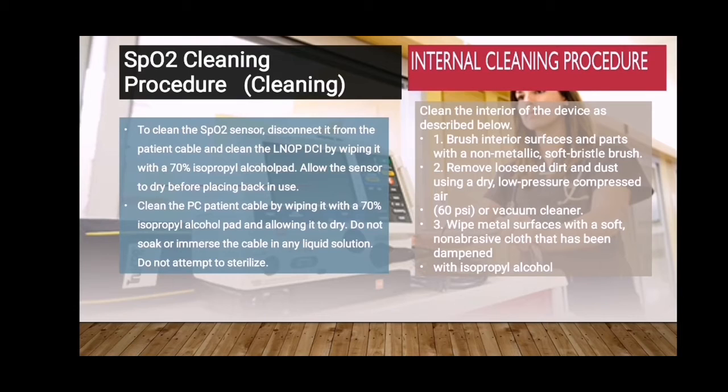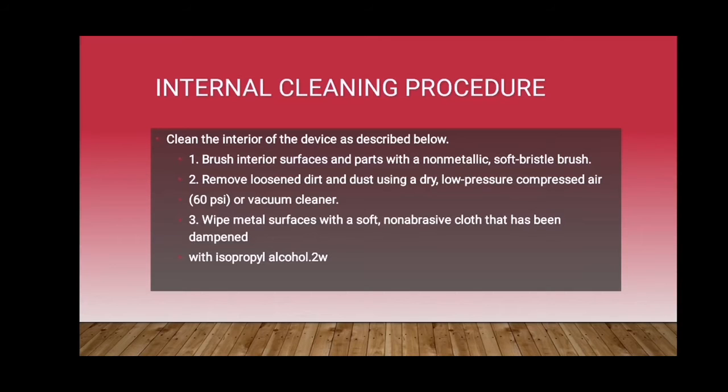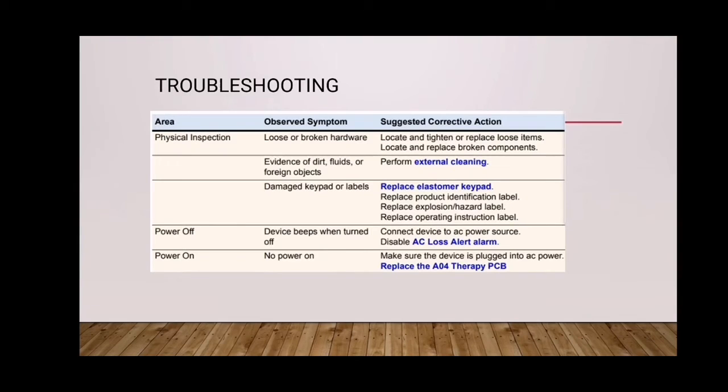This is SpO2 cleaning and internal cleaning procedure. You just need to follow this guideline. Troubleshooting of this device, the defibrillator.